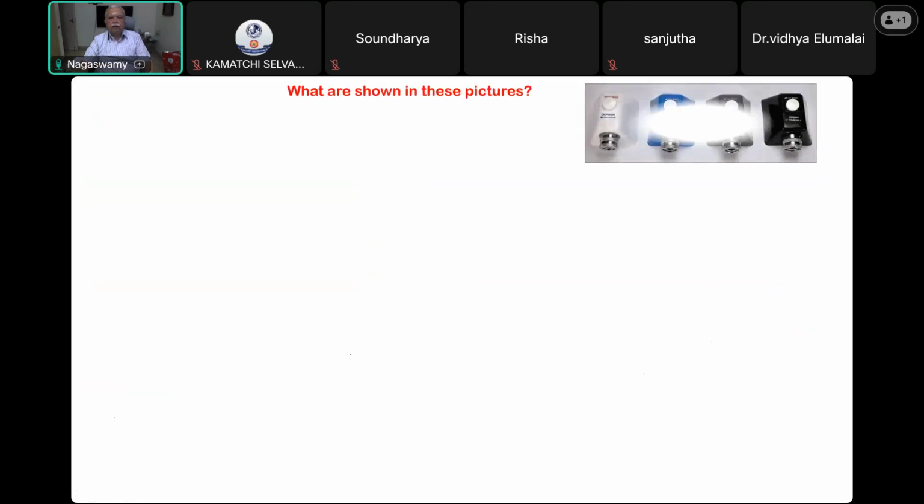So what is shown here? Wall mounted pipeline inlets. Gas outlet, central supply outlet in the wall. And what other things are you seeing? You must describe all the things about it. It is color coded. What is the name of this outlet? Is there any specific name? Non-interchangeable quick couplers or non-interchangeable screw thread.